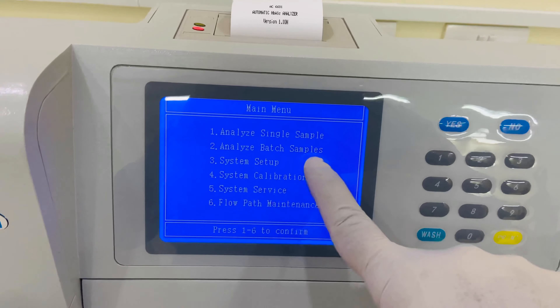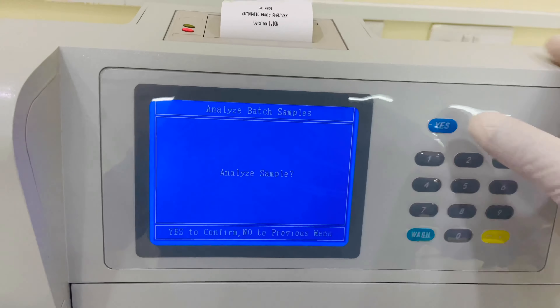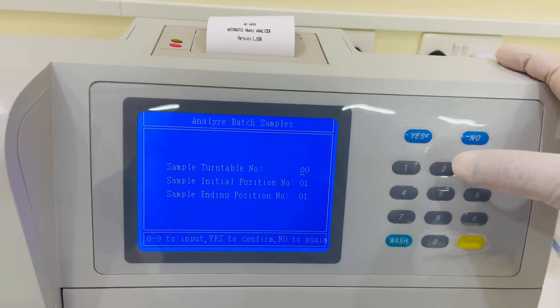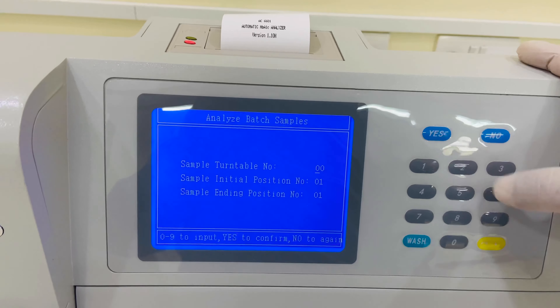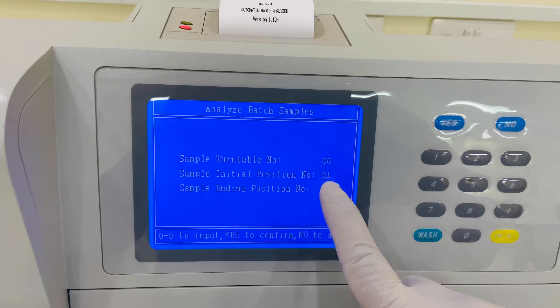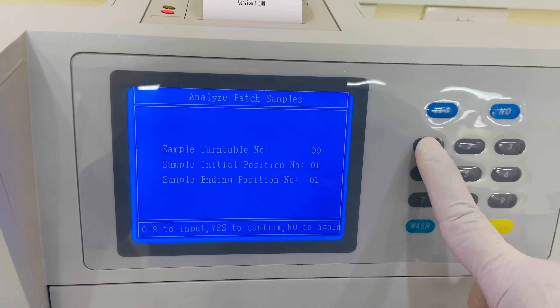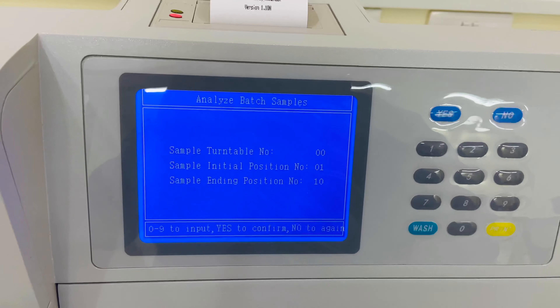If I press option number one, it asks to put the sample in the ST position. ST means single test. If you have only one test, you place it there. I'll select 'No' for now and show you option number two.